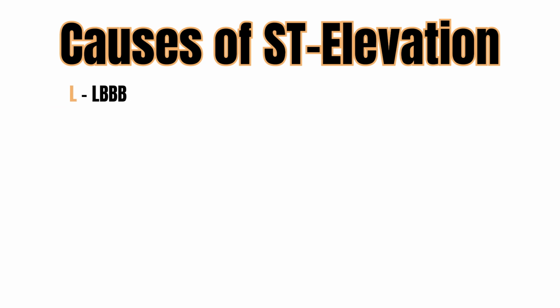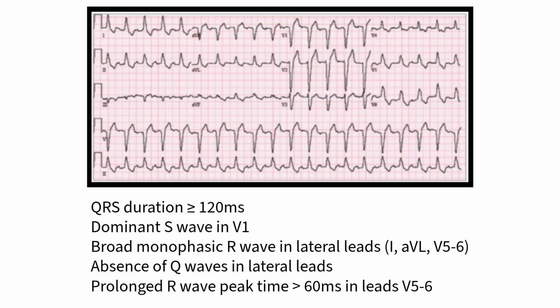Now let's talk about the next thing on the list: left bundle branch block. Before we dive into ST segment elevation associated with left bundle branch block, let's first define what left bundle branch block is, and here's some criteria for that.